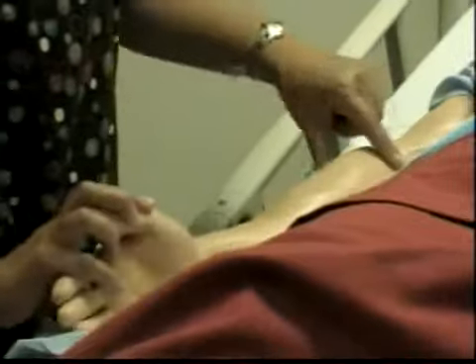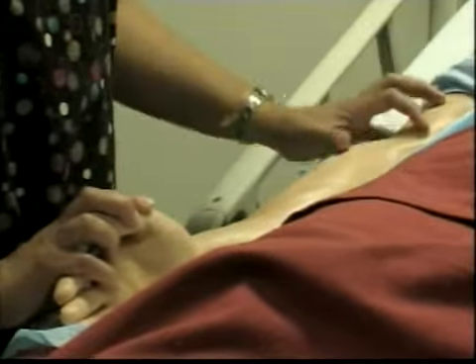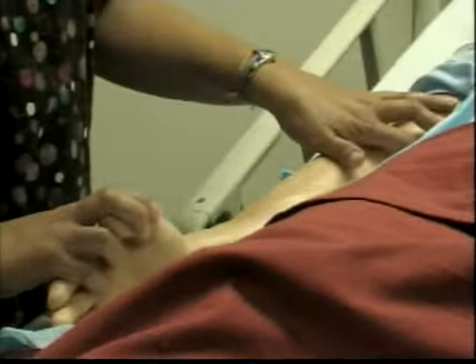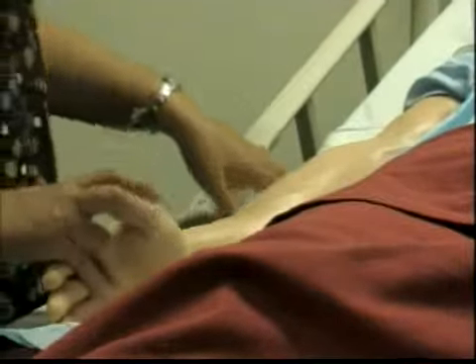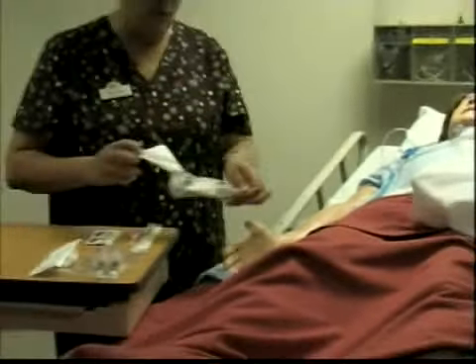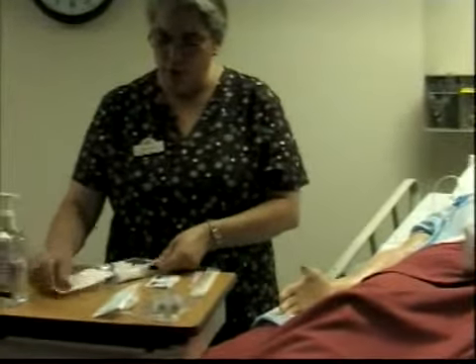If you started up here and it gets infiltrated and all this is swollen, you cannot come down here and start an IV because you actually will be aggravating the infiltration. So you're going to have to move to the other extremity. So you'll open your packet. You already had explained the procedure to your client and washed your hands. You open your packets and have everything available to you.